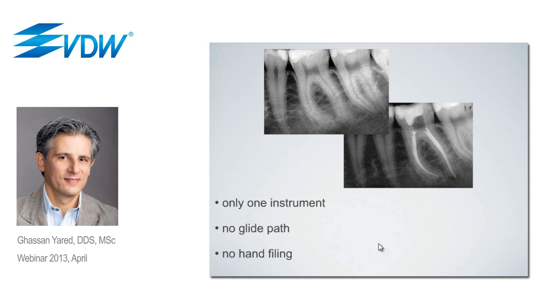Now, for this case, the working length was estimated from the radiograph. A stopper was placed at that estimated length minus 4 or 5 millimeters. The instrument, the R25 here, was used as described with a packing motion, 1, 2, 3, very small movements, taken out, patency, irrigation. We continue doing that until the instrument reaches the estimated working length minus 4 or 5 millimeters. Then a hand file, number 8 or 10, straight, is placed in the canal to determine the working length with an apex locator, preferably.